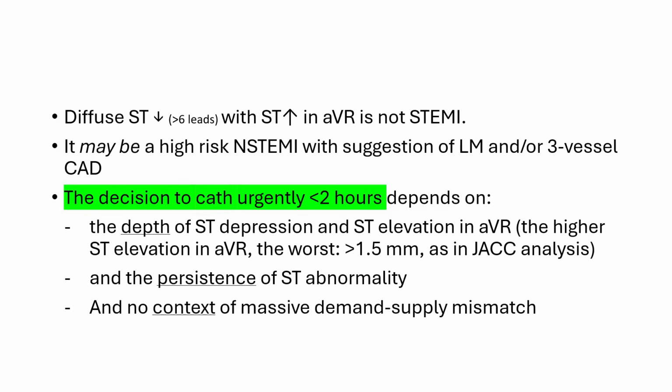Now, do we need to cath these patients urgently? Not necessarily. Urgent cath is needed only in case of deep and persistent ST abnormality, for example, persistent over 30 minutes or so, in the absence of a context of demand-supply mismatch like severe anemia or non-cardiogenic shock.